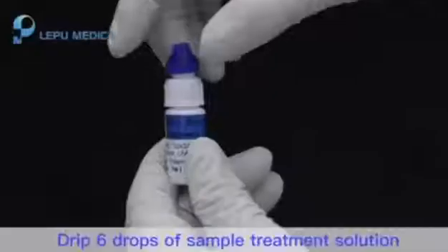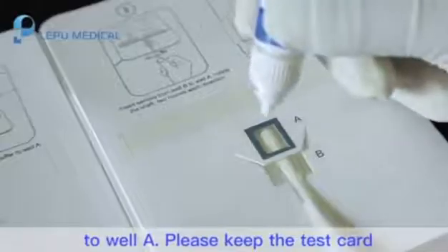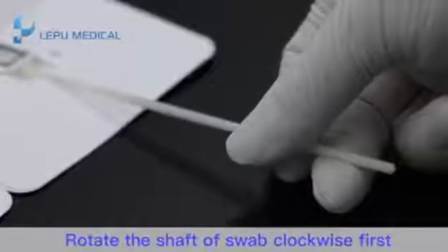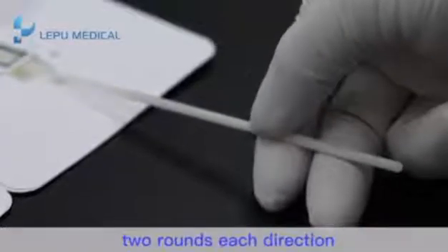Step 5: Drip 6 drops of sample treatment solution to well A. Please keep the test card flat during operation. Rotate the shaft of the swab clockwise first and then counter-clockwise, 2 rounds each direction.